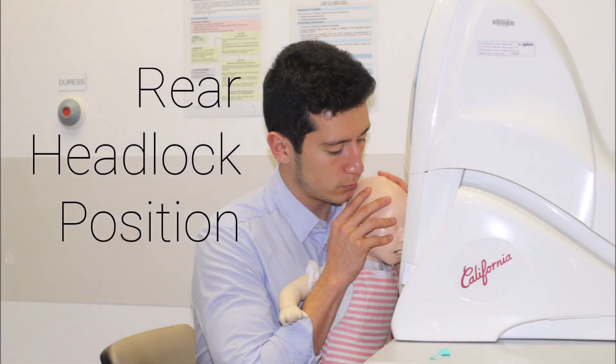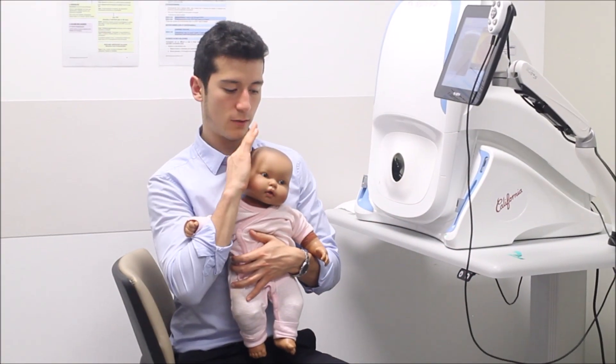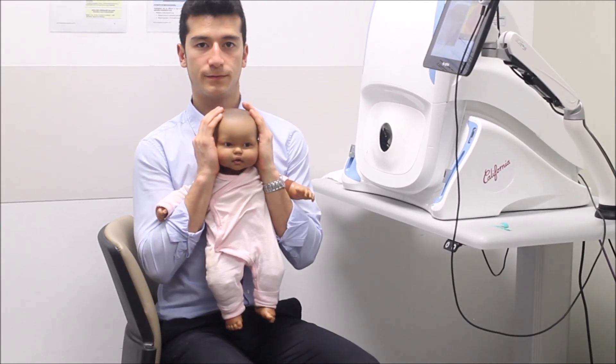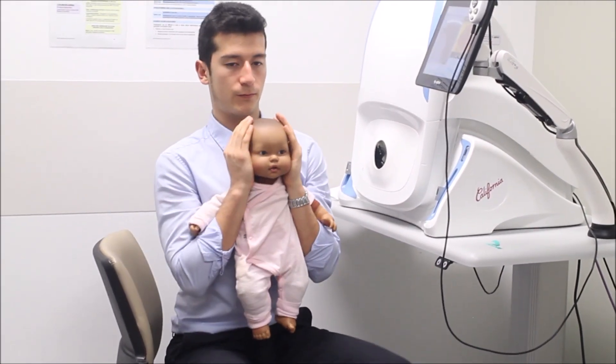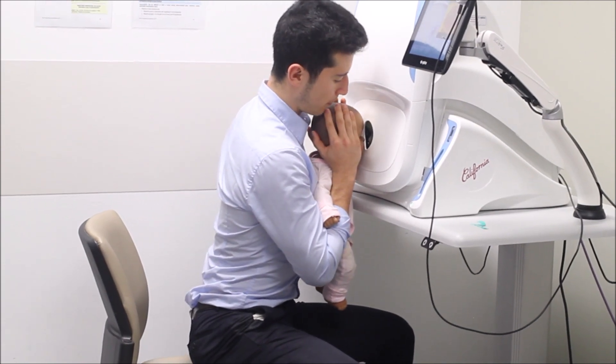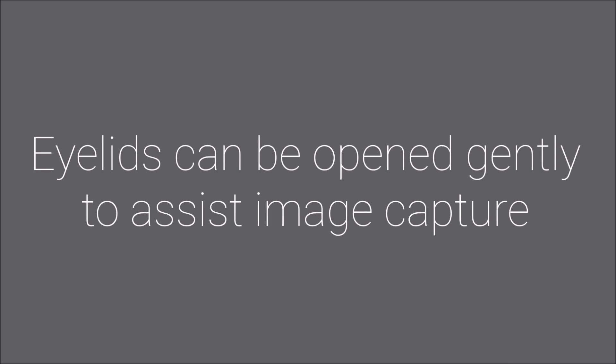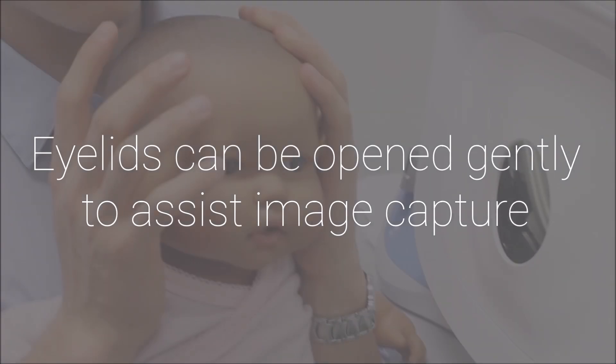The rear headlock position is especially useful in an uncooperative patient that is combating the machine and is best performed in a seated position. Tuck both hands underneath the child's armpits and stabilise the head on both sides. Guide into the camera's aperture. The eyelids can be opened gently to assist image capture.